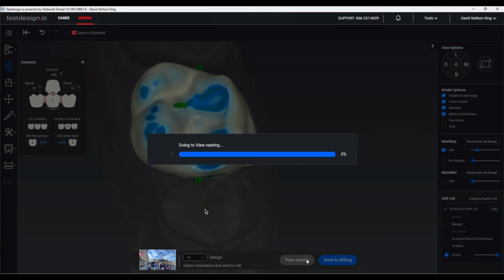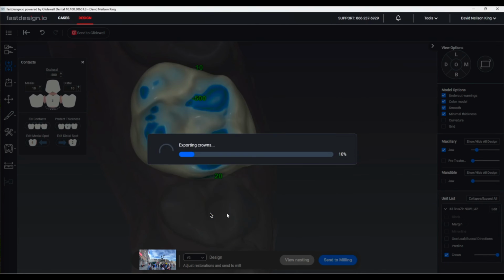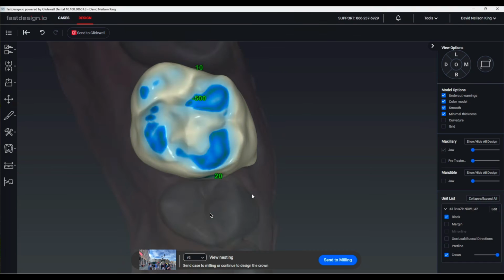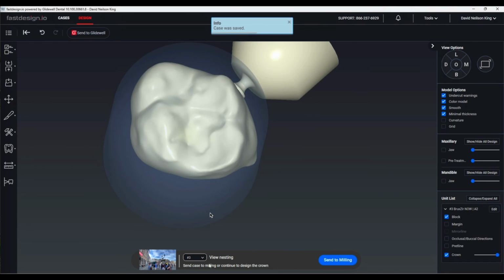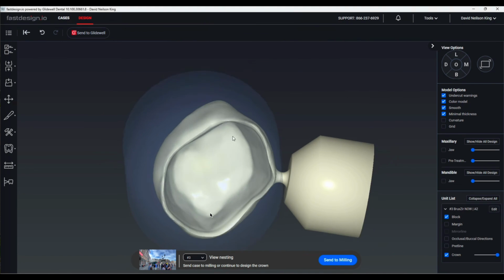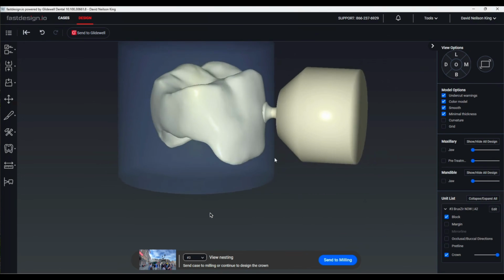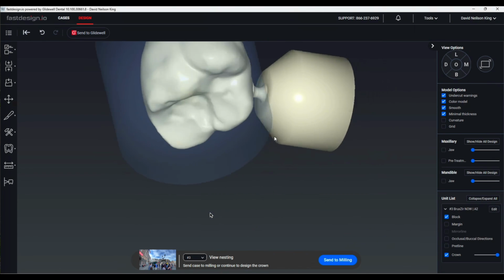And then let's see what it's going to look like in the block. So at this point, if I wanted to, I could change, if it was an option, that is, but I can't, so I won't. So here is our nesting. You can see what the restoration is going to look like. We didn't get any errors. I thought we might run into a height issue, but we're not. So let's send that puppy off to milling.